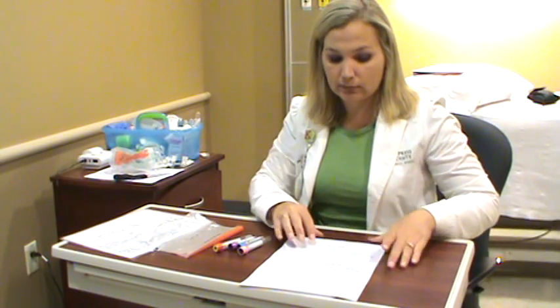You also want to avoid areas that are swollen or that appear bruised, and areas with hematoma. Avoid fist pumping too — a lot of people put the tourniquet on and tell the patient to pump their fist, but you shouldn't do that. Just holding a nice tight fist is appropriate. Constant fist pumping can cause increased potassium levels.